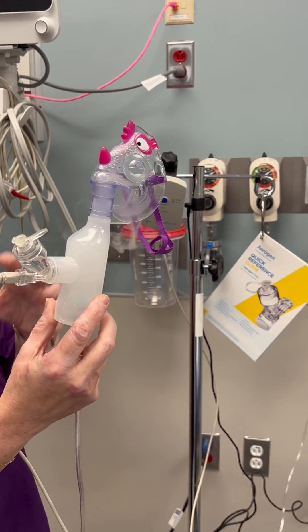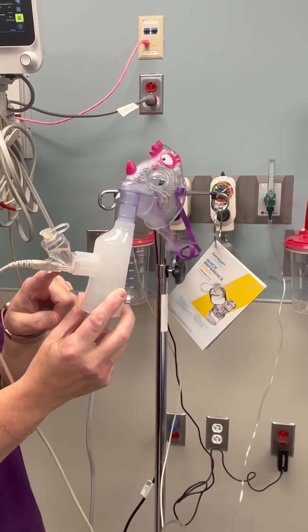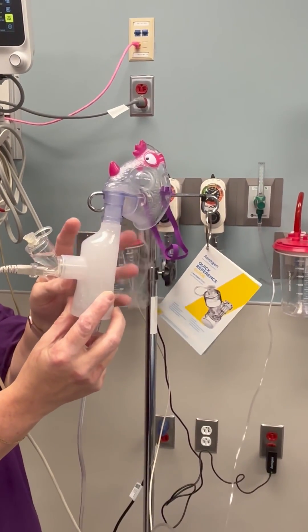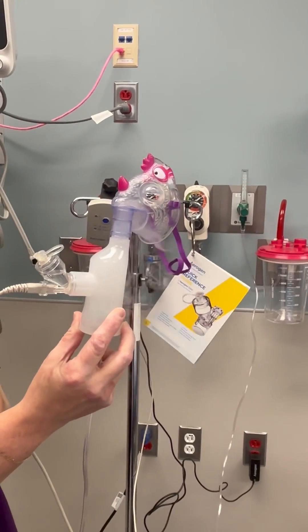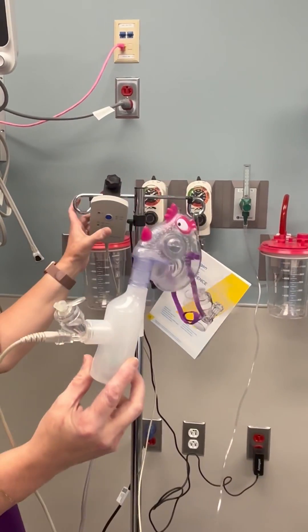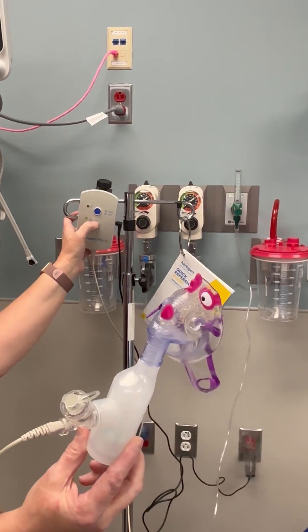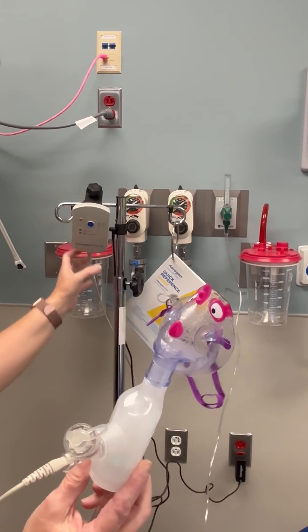You'll know when it's completed when everything is gone — all the liquid is gone from this little chamber. This might still be cloudy, so wait until that's clear. Once that's clear, the treatment's done. This runs for 30 minutes, but when the treatment's done, you can just go ahead and turn that right off.